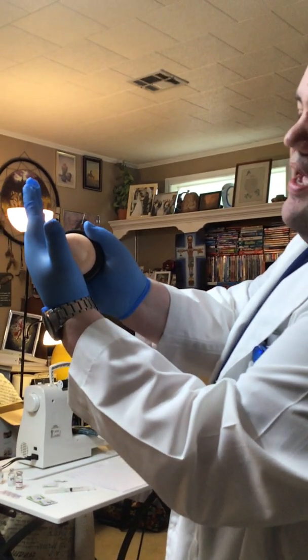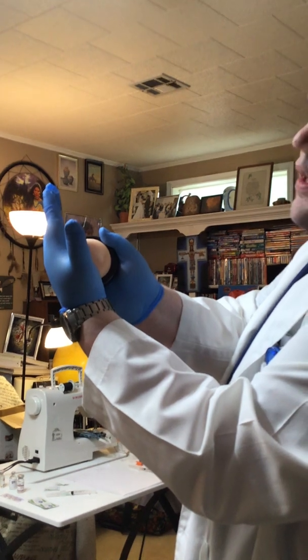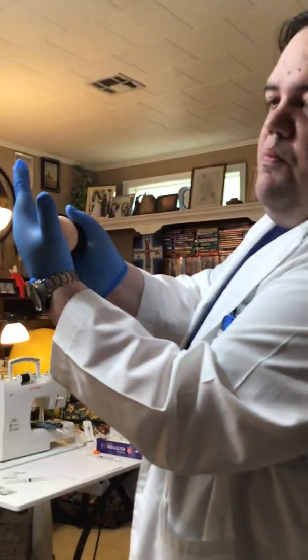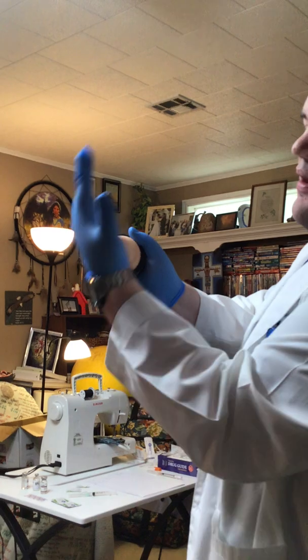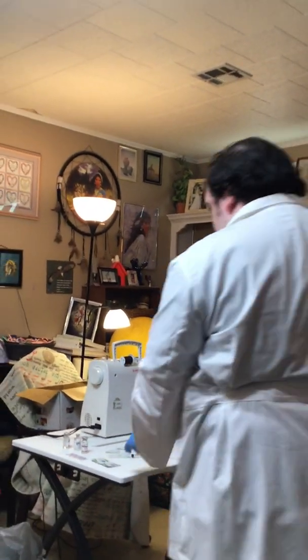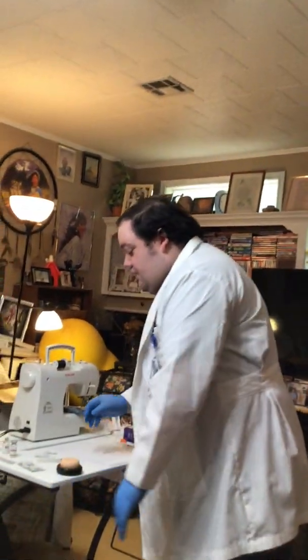I inject the medication slowly, no less than about 5 seconds per cc. When I'm done, I slowly pull the needle out, and as the needle comes out, I let go of the skin. It's going to come back in place. I don't have a third hand to hold it up, so that's what we're going to demonstrate now.